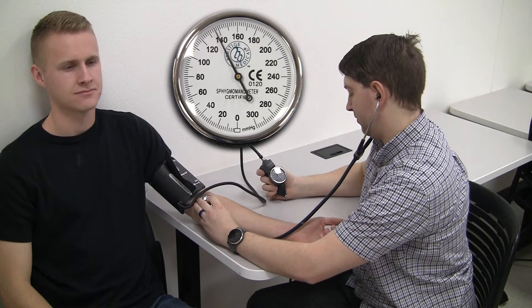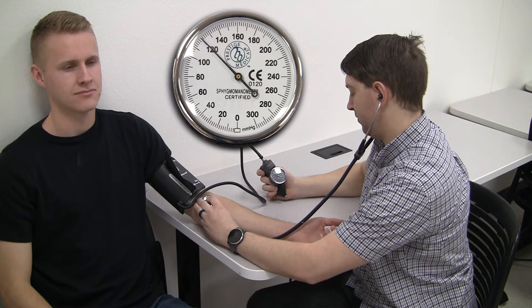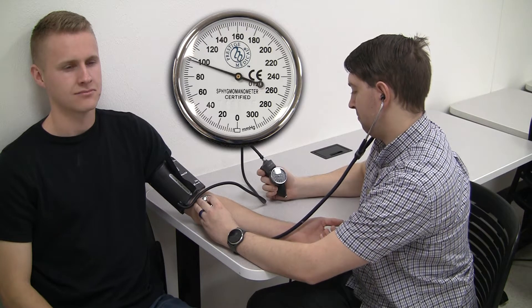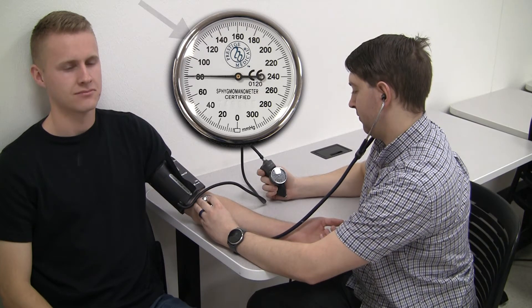We'll inflate the cuff about 20-30 mmHg higher than what we estimated the systolic pressure to be. We'll slowly release cuff pressure and listen with our stethoscope. That first tapping sound marks the systolic pressure — looks like it happened at 115.